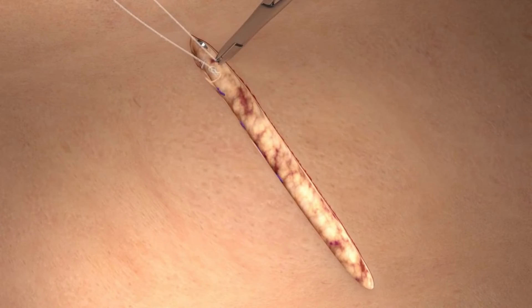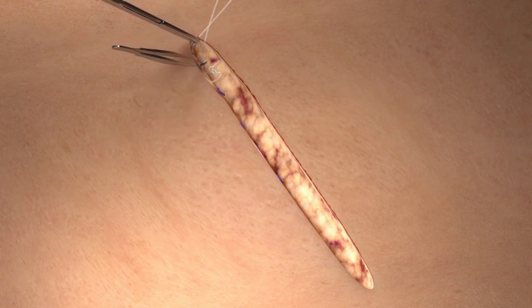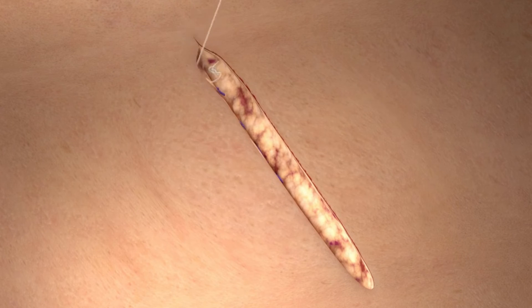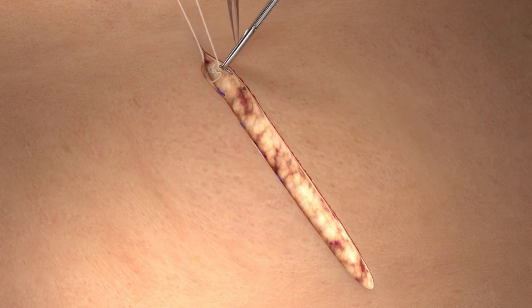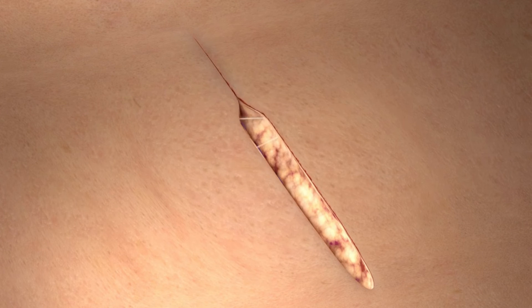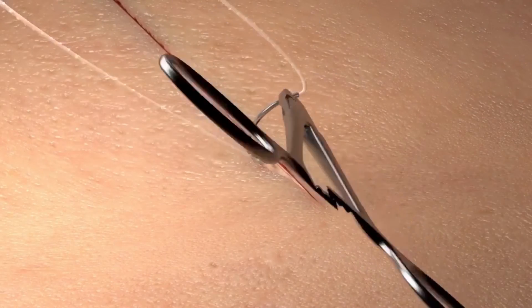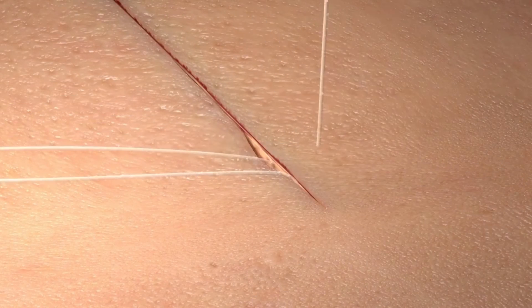In a running subcuticular fashion, take equal bites of the tissue in the horizontal plane of the epidermal-dermal junction. It is important to come directly across the tissue line when deploying the device on the subcuticular layer to ensure good apposition. Once the apex of the incision is reached, simply exit lateral to the incision coming out of the superficial skin and then cut flush.